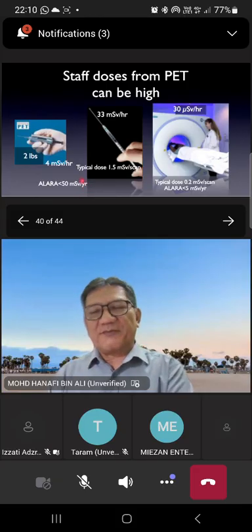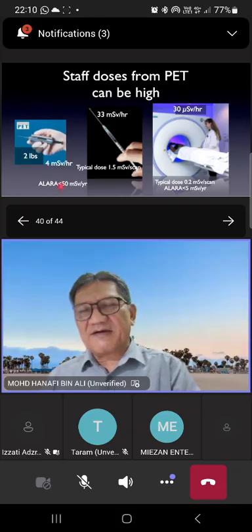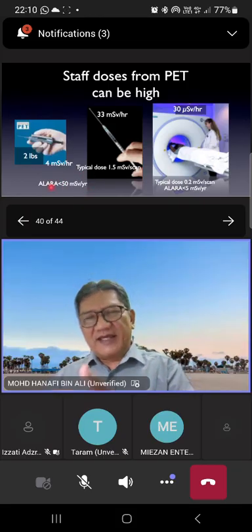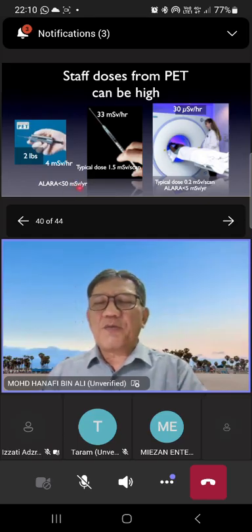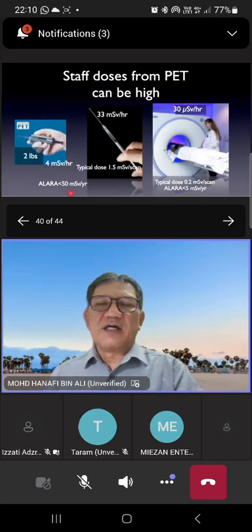radiologists or cardiologists must be inside the CT scan room, and this personnel is normally exposed to the radiation.